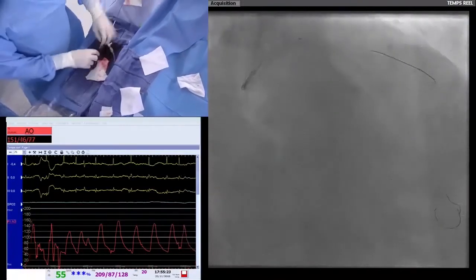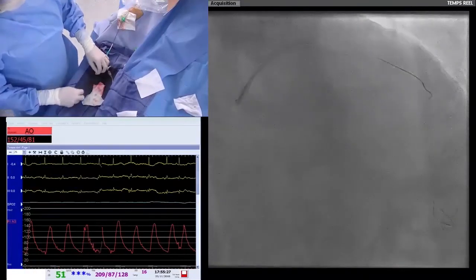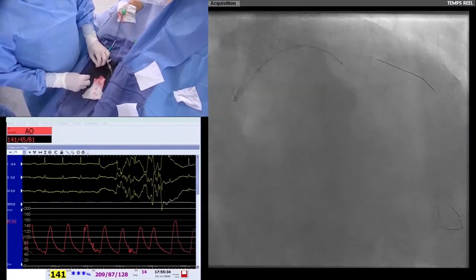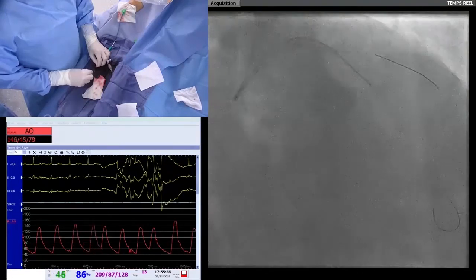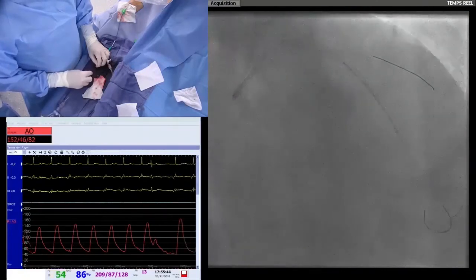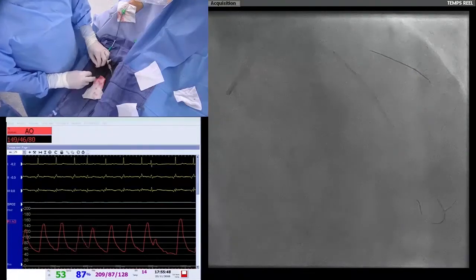The stent is inside the left main, so I will advance the guiding catheter a little bit to be coaxial and to have better pushability, a better backup support. And I push the stent slowly, and you can see it is crossing the lesion. It travels really nicely. Yeah. Not so bad. I will place it maybe.